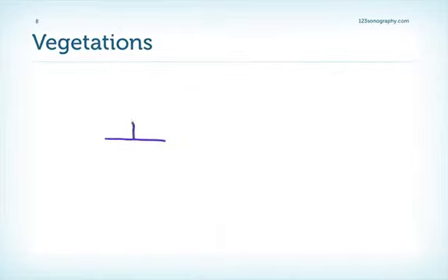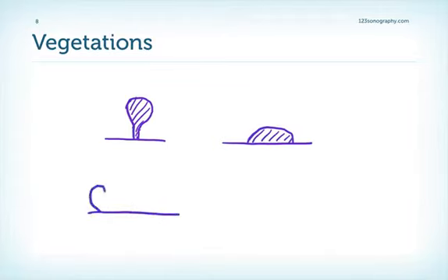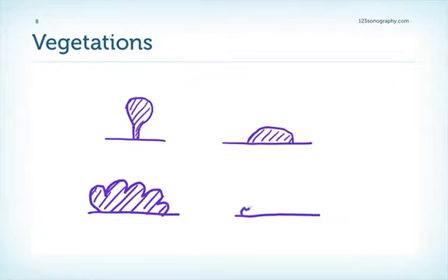One word about the shape of vegetations. Well, I've seen all sorts of shapes. This is a fairly common type where we have a very narrow base. Usually those vegetations are very mobile. Then they can look like this, broad-based and not so mobile. Finally, we can have all sorts of bizarre shapes, grape-shaped or lobulated, or a combination of all different types of vegetations. And then finally, probably the most difficult type of vegetation to diagnose are those here, where we have a very flat vegetation on the valve. We see those, for example, in the setting of fungal infection.